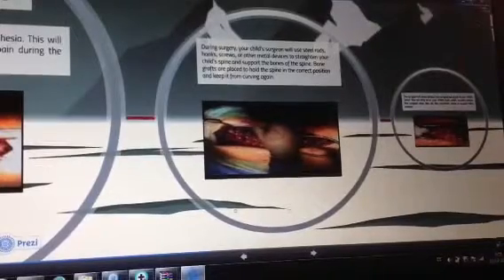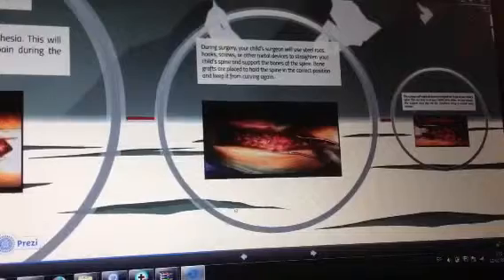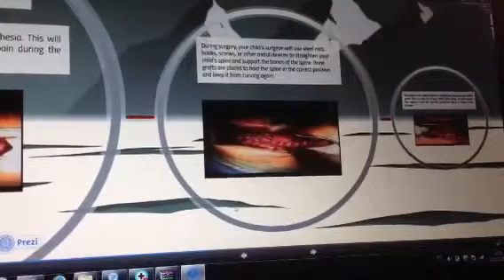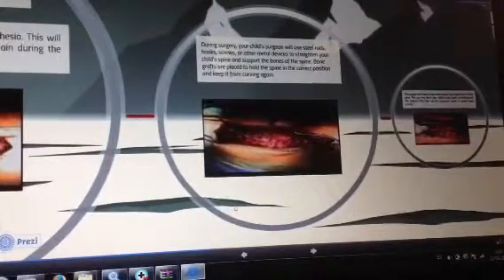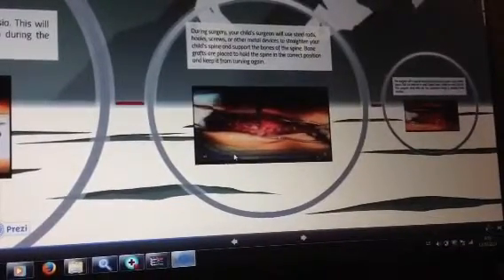And so here, moving my way up the spine in a cephalad direction, placing screws segmentally at each level gives us maximal control of the curvature. And the key is to place these harmoniously so that the uniplanar screws line up in a harmonious fashion.